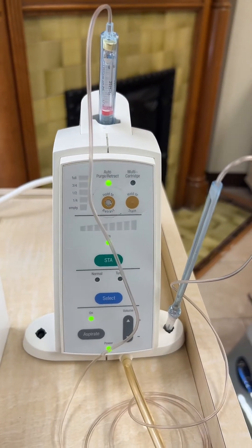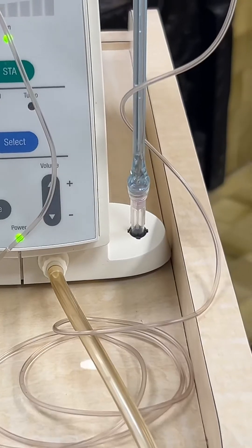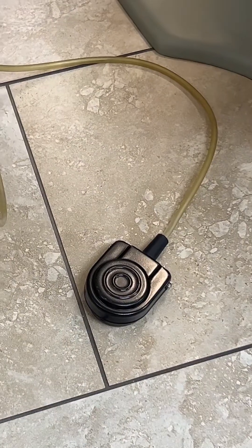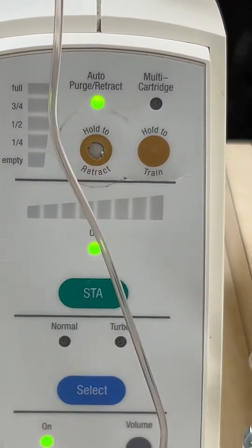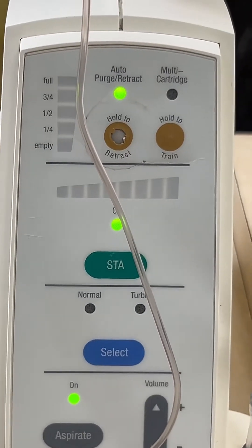One of the biggest benefits of this unit is that you can work almost immediately once you numb the patient. You put the needle in the PDL — the periodontal ligament — use the foot pedal to start the local anesthetic flowing, and watch the meter build up pressure. You typically use about one-third to maybe half a carpule per one to two teeth, and you can get the tooth so numb you can do a root canal or even an extraction. The anesthetic lasts about 30 minutes, so you do have to work fairly quickly, but the nice thing is you don't have to wait.